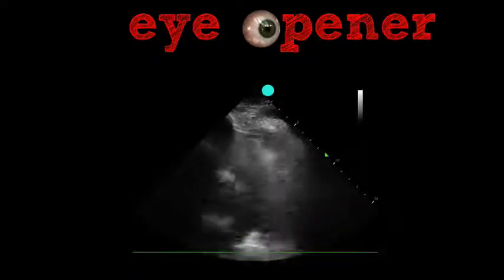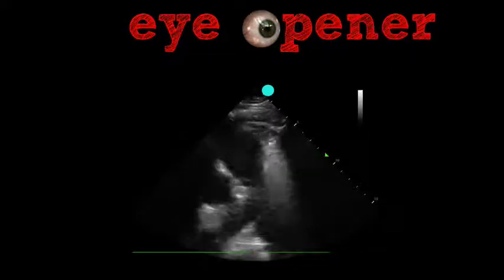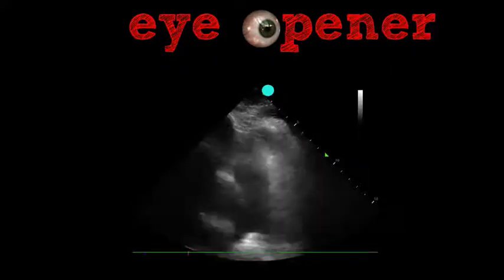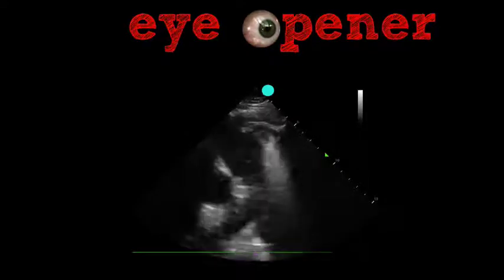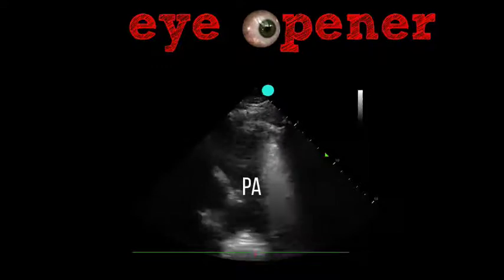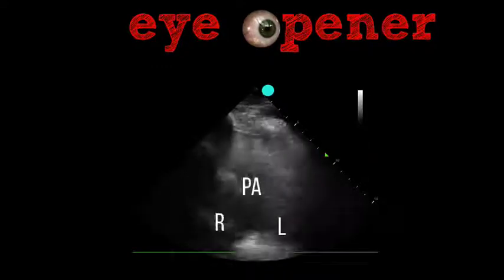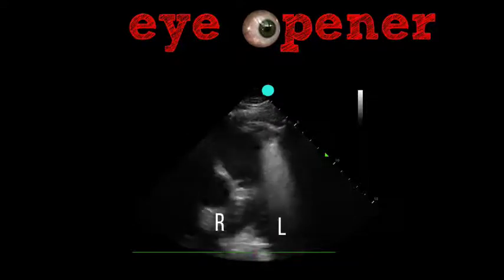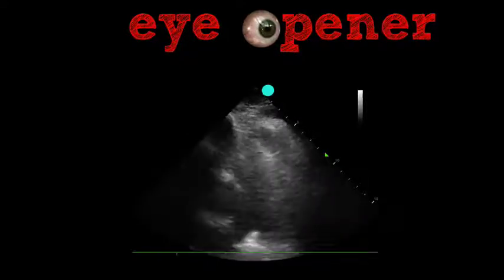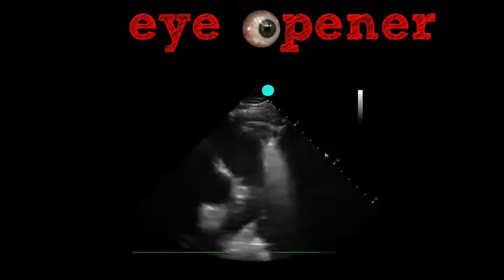And so I go searching for this pulmonary artery, looking for a clot. And here is a view of the pulmonary artery branching into the right and left branches of the pulmonary artery. And I don't see any evidence there of clot or saddle embolism. The pulmonary trunk certainly appears dilated.